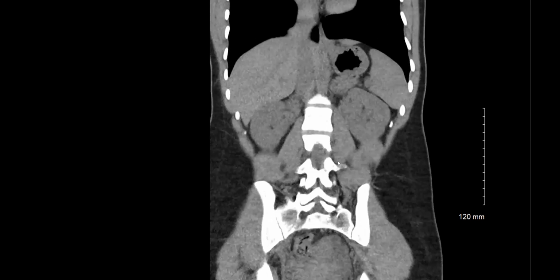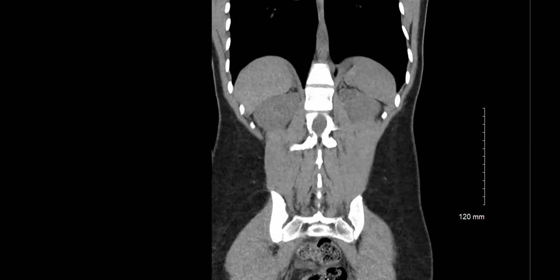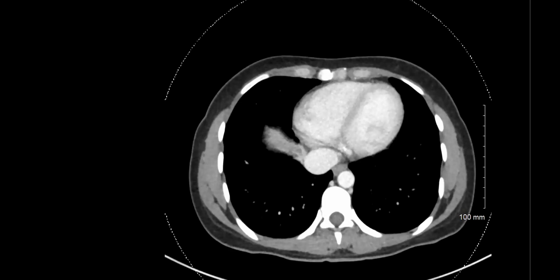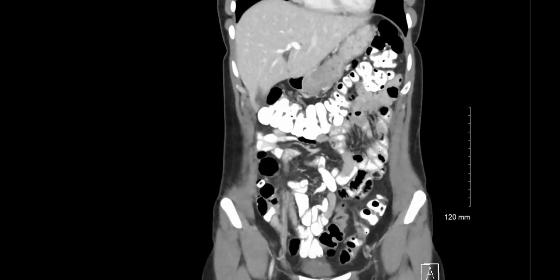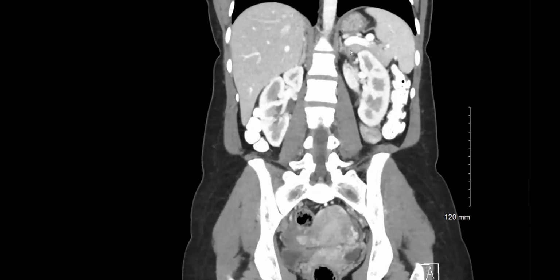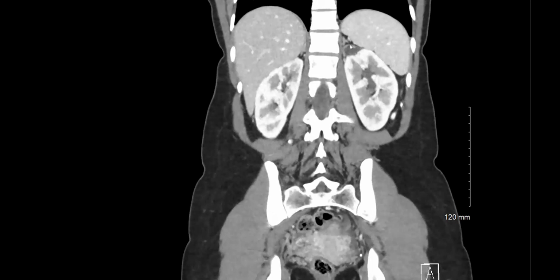And on this non-con, if you go through the axials and the coronals, you see the left kidney, not given contrast. We don't see anything spectacular. There's some atrophy and there was some cystic thing in the upper pole of the left kidney. Is that like a second moiety? You are too sharp. I thought I would show you that finding more on the post contrast, but maybe it's the shortage of contrast, Aarti, that has sharpened you. Okay. Yes, I'm very paranoid now.